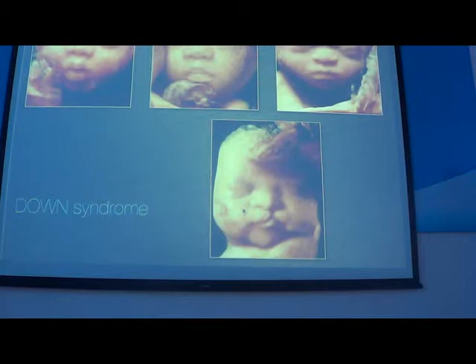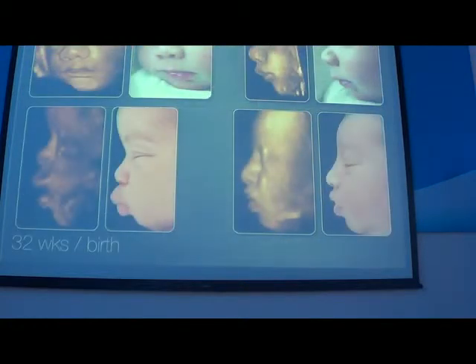So this is nice, but there is no real benefit, because if we have to do the diagnostic of Down syndrome, it's not to do it in the third trimester of the pregnancy, but it's to do it in the first or in the second trimester. And this was a Down syndrome with also cleft lip.